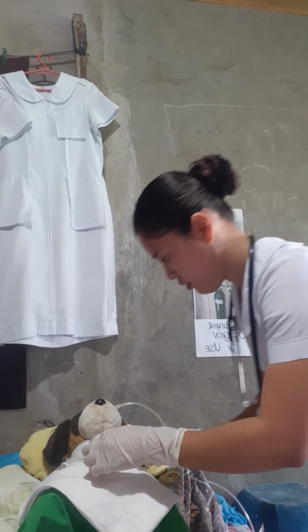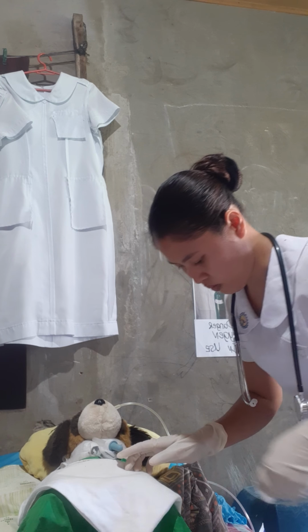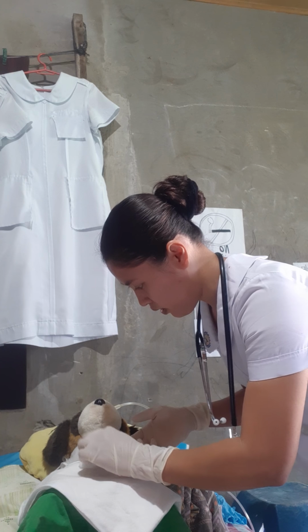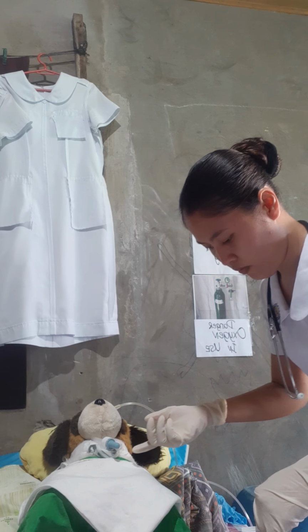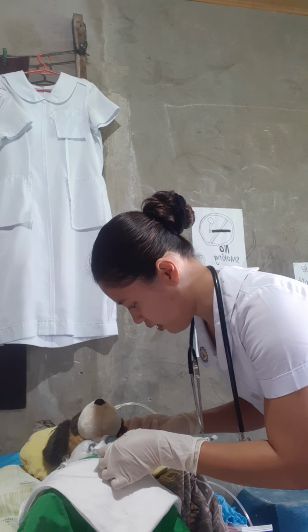Afterwards, place a new one, but before that we need to pat it with the 4x4 gauze pad before placing another one.